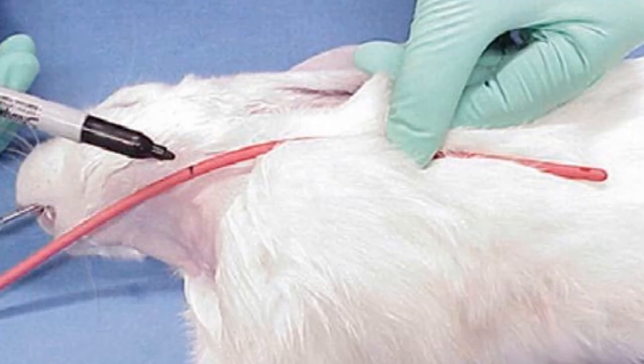Important note: during pre-measuring, you are already sterile and gloved. Your tube is also sterile because you are going to put it inside the patient's body. So if this is the tube that you will be using right here, you cannot use that anymore because it has touched the body of the animal, which was not aseptically prepped. Again, do not forget your surgical asepsis techniques.